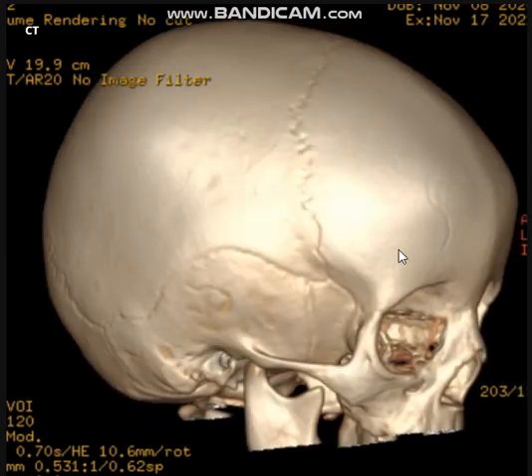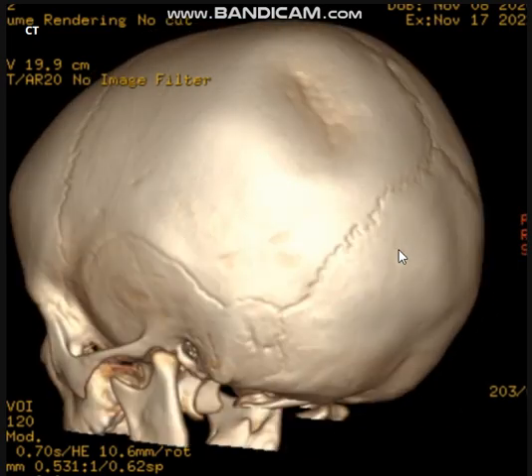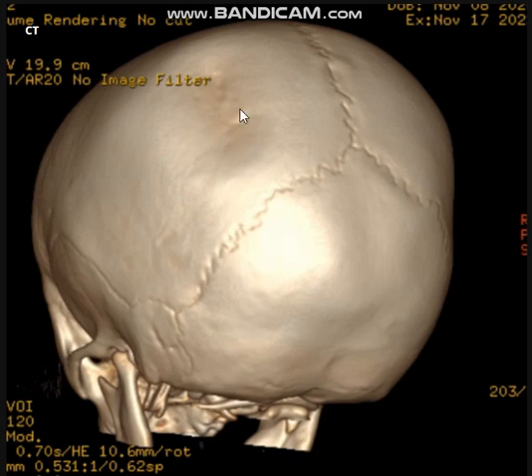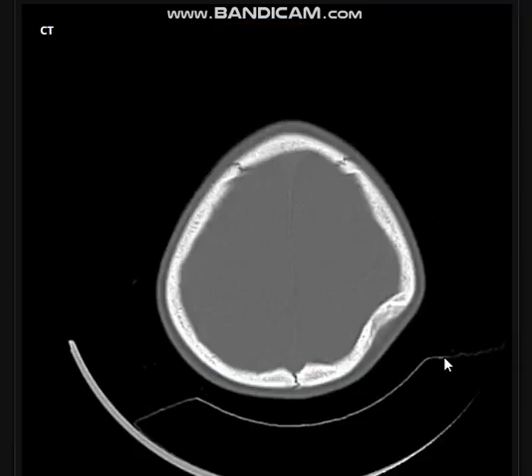This is again the 3D volume rendering bone window, and we can easily identify that on the left parietal bone we have a depression or indentation of the skull bone. On the axial images, you can see this is not a true fracture but just an indentation of the skull.